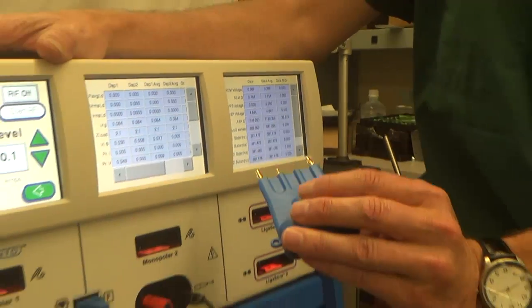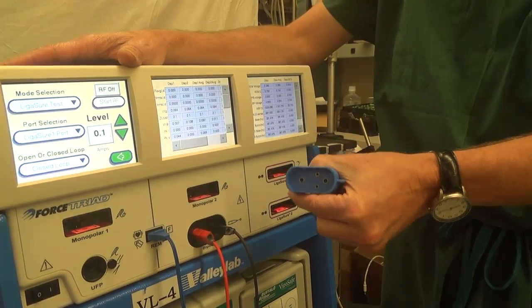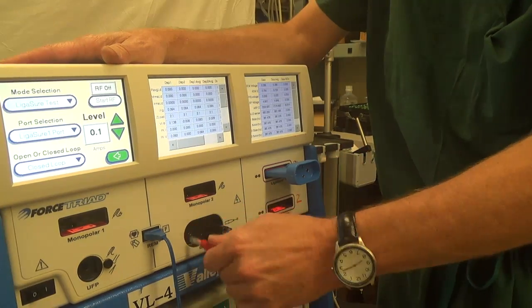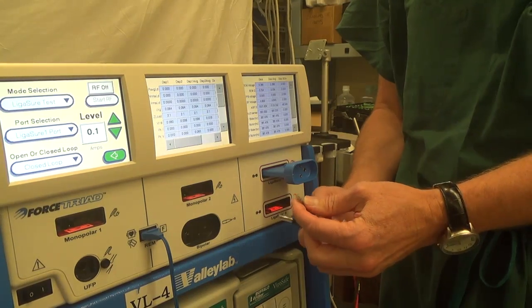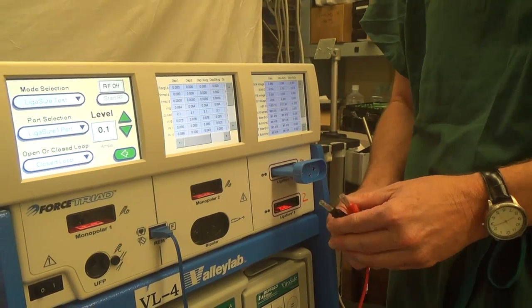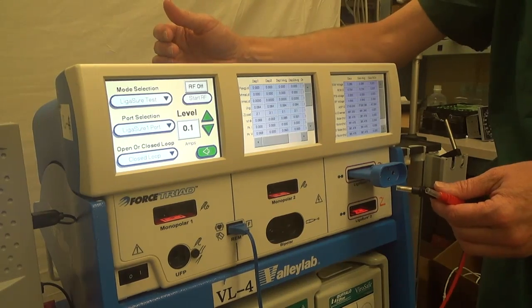Now, there's this adapter where you connect your old style, this is the old style Ligasure, in case you have the old Ligasure only device. I like using this device because I like using these shielded banana plugs. Shielded means that when they're not in use, there's no electrical contact capable. And when we test ESU devices, you have to be very careful because you're delivering, in one case, 5.5 amps. And that's quite a bit, and it will burn you.